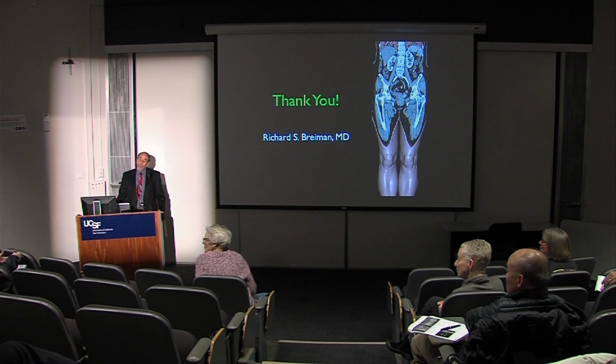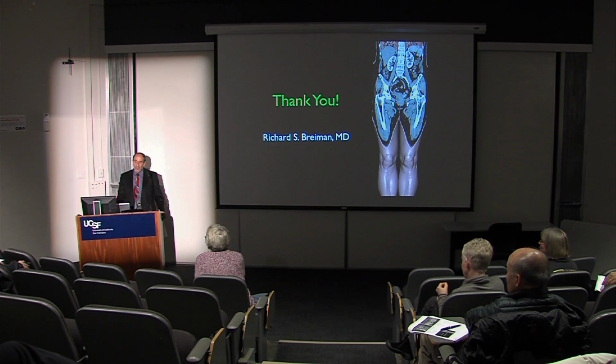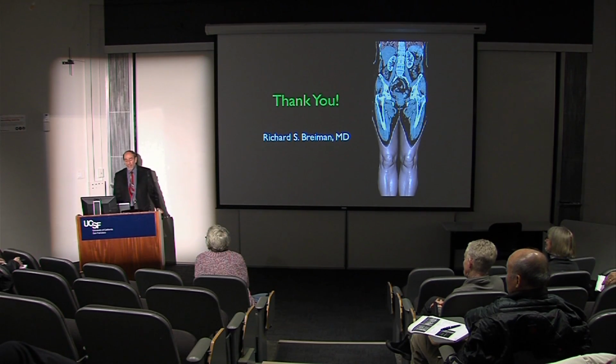That still excites me. Who creates these programs that change the CT scans to the 3D models? And then do they send trainers out to teach you how to do it? They do. How do you learn how to do that? Well, nobody trained me in that. I sort of just figured it out. Like the 3D, the computer graphic manipulation.